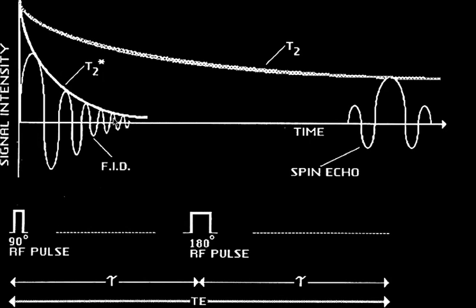The fixed magnetic field changes that cause the very rapid shortening of T2 star typically aren't real important. They tend to be the interfaces like cell membranes and things like that, which allow you to have fixed variations in the magnetic field. And that's why typical gradient echo images don't give very good contrast. You can have a T2 star image and you can have a big tumor there and you can't even see it. Or you can have a big inflammatory lesion or an infection and not see it because T2 star is not as sensitive for the biochemical changes which occur in tissues.